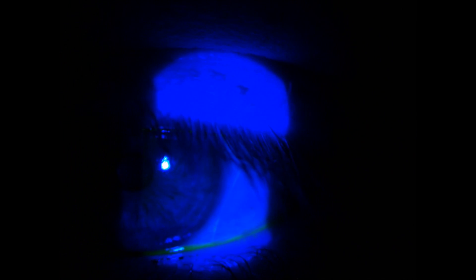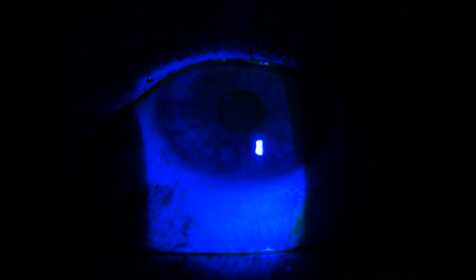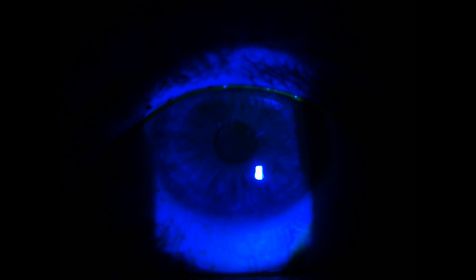Now we're going to assess the cornea for any staining, and we're going to look at the tear breakup time also. The first thing we want to do is just a general sweep across the cornea. You might be able to pick out on the video some slight staining — it's quite superficial, about 5 o'clock. Then we'll get the patient to look up just to look at the inferior cornea — not really seeing anything there, so that looks all good. Then we'll get the patient to look down and lift the upper lid up just so we can assess the superior cornea — that looks all nice and healthy.